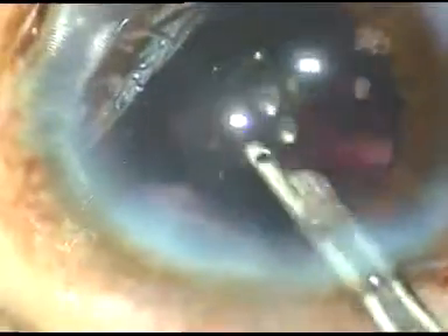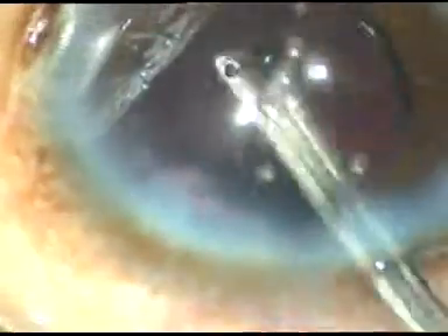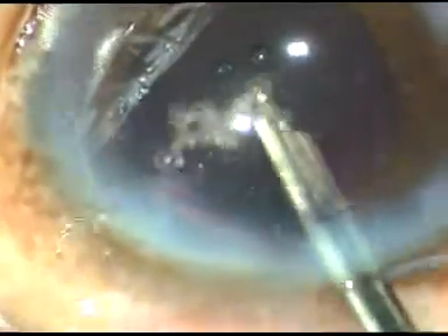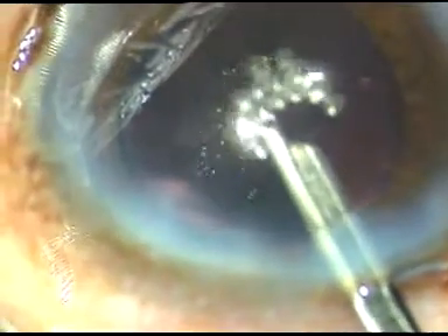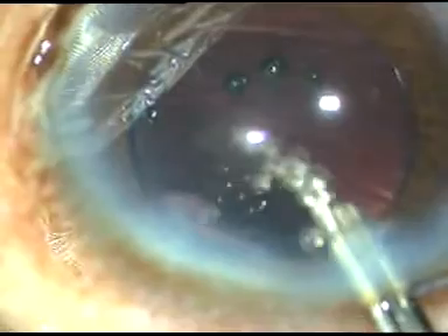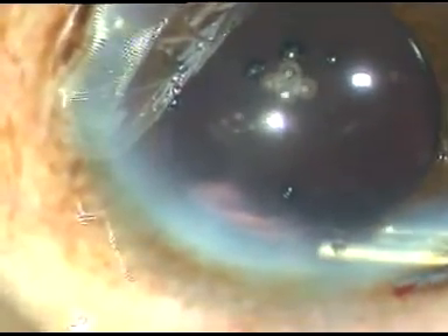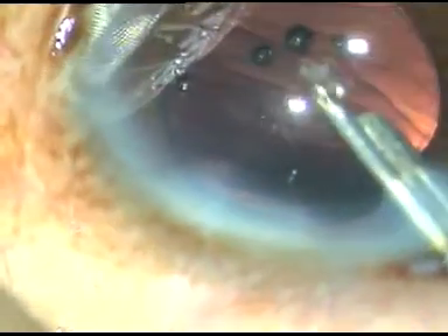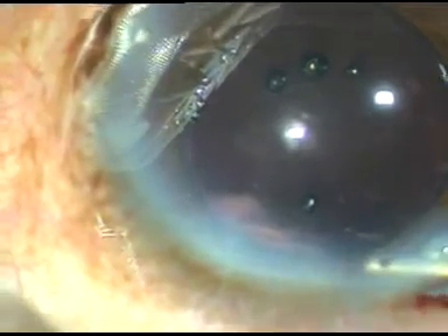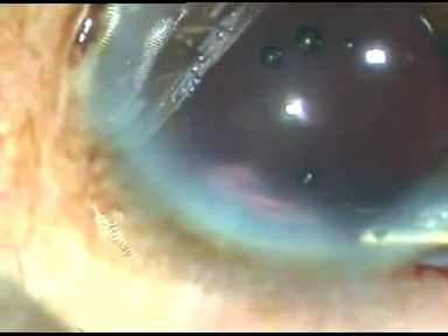In this case you have seen how to perform rhexis using only HPMC, and how to do the submarine chop — going into the substance of the nucleus near the opposite equator and then chopping the nucleus. It is a variety of horizontal chop. The anterior chamber is formed and the case is concluded. Hope this video will help you in developing your surgical skills.